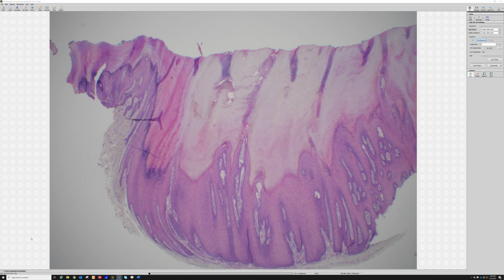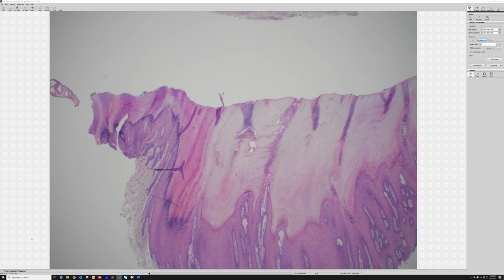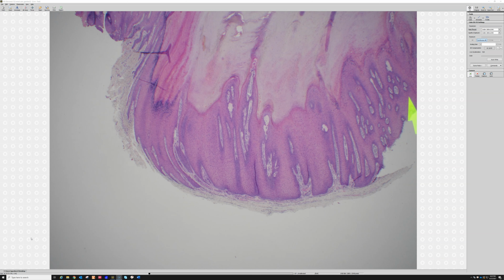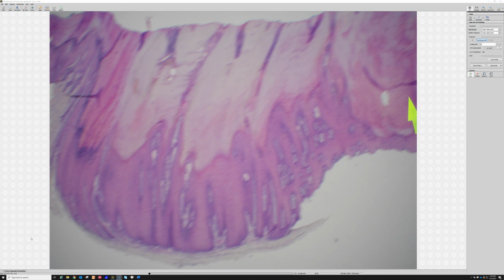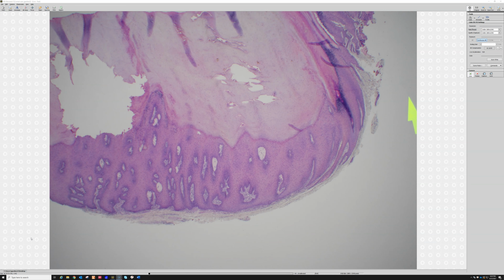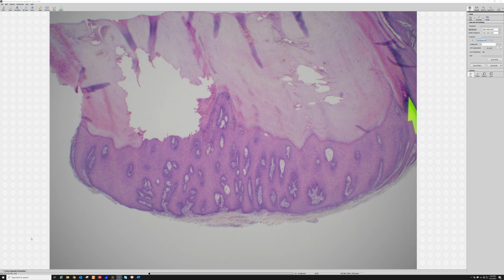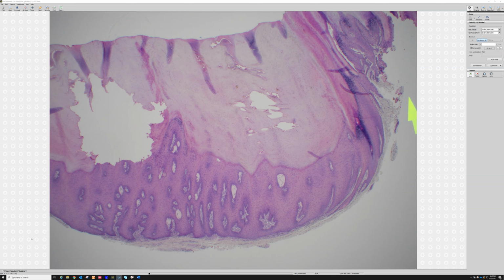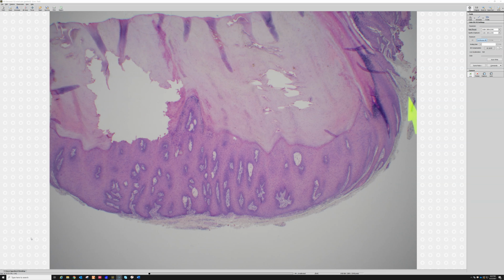Okay, so if you do a shave biopsy on this, a normal shave, you won't even get the tips of the papillae. You'll just get the top of normal skin and then stratum corneum. That's it. So you really have to get deep down under this with the blade and pull it out like a plug. I don't exactly know how my awesome derm colleagues get a great specimen like this where they pop the whole thing out, but they just got right under it. This is a perfectly removed example, really nice because they got all the way under the lesion and just popped it out.